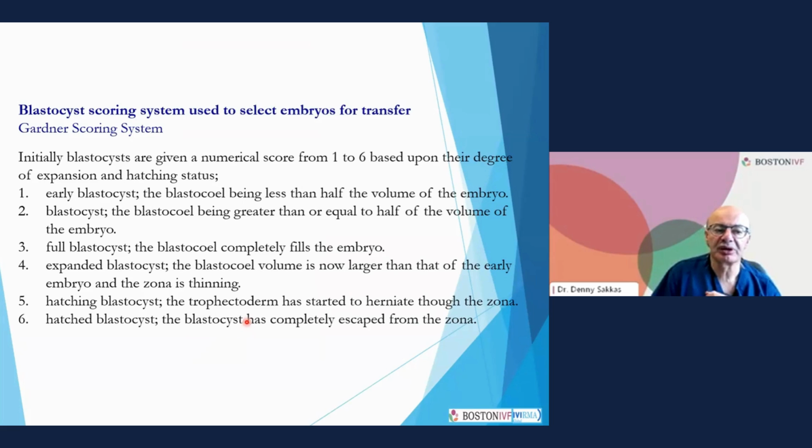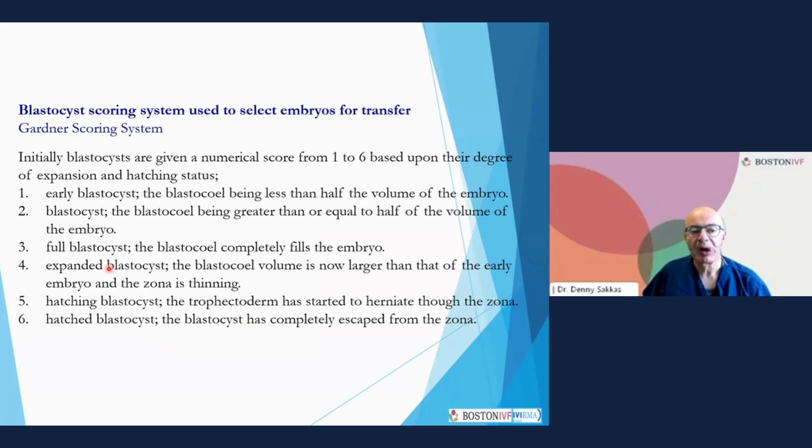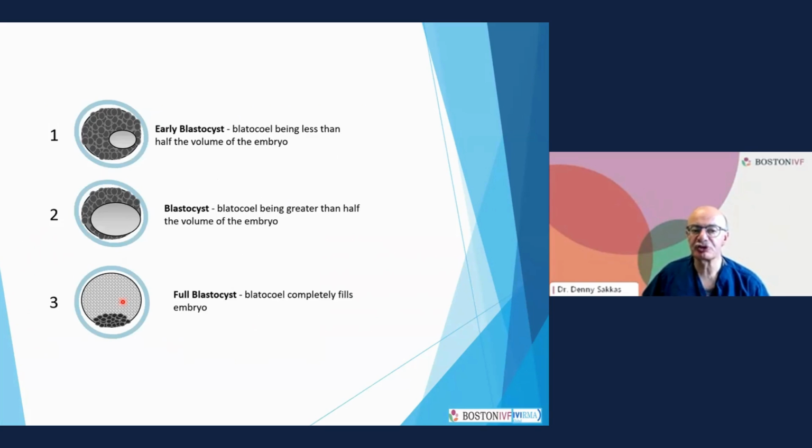So we look at a number of things. We look at how expanded this is, so how much volume it takes, and the greater the volume, the better it is. So if an embryo in our scoring system has a high value, it is a better embryo. But the key factors are 2 other things. So we obviously look at how well it's expanded. You can see this embryo, which interestingly, because all the divisions are minimalistic, the blastocyst at this stage is the same size as an oocyte, as the big 1 cell that you saw before.